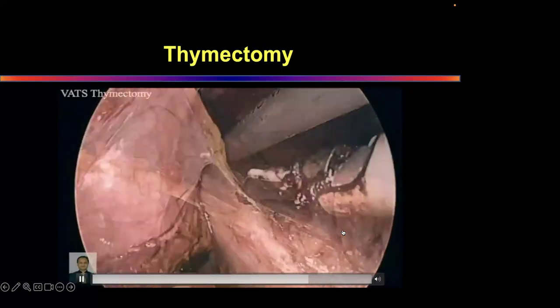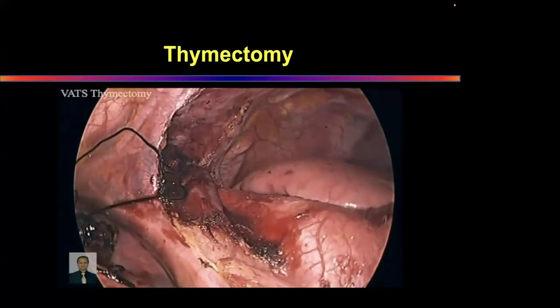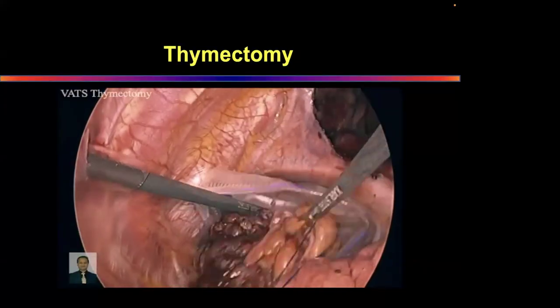So this is the right side thing. As you can see, a very extensive radical thymectomy has been done. All the fat, all the gland has been removed.